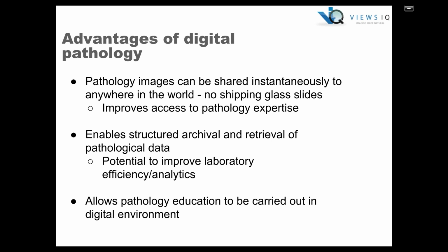Digital pathology also allows for more efficient management of pathological data because images can be archived and retrieved in a more organized, intelligent way. And digital images are also very useful for pathology education because they allow an entire group to view a single slide while avoiding the variability that comes from serial sections.